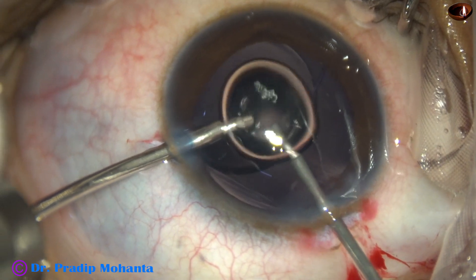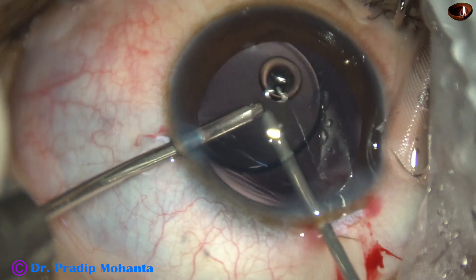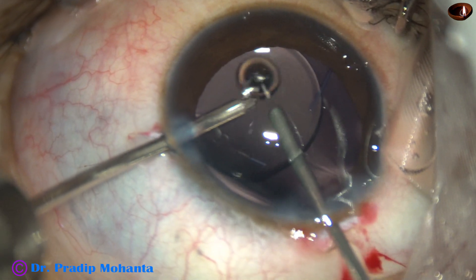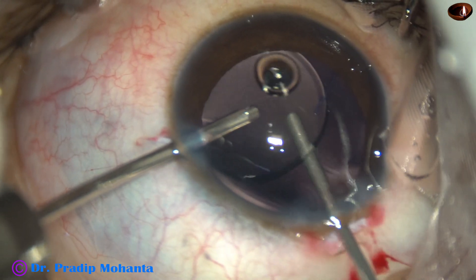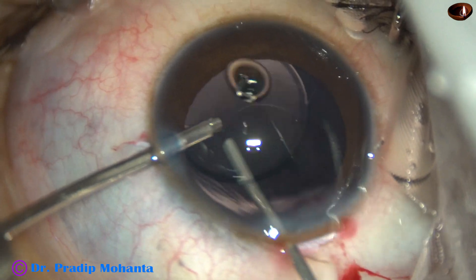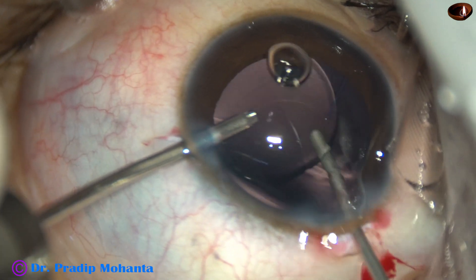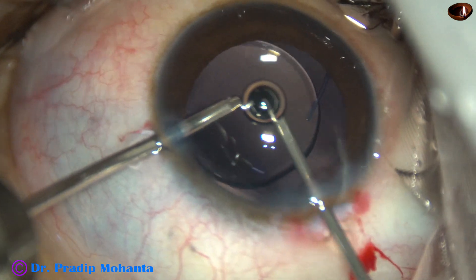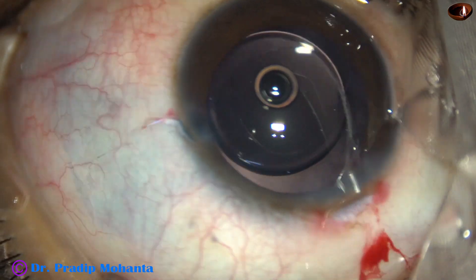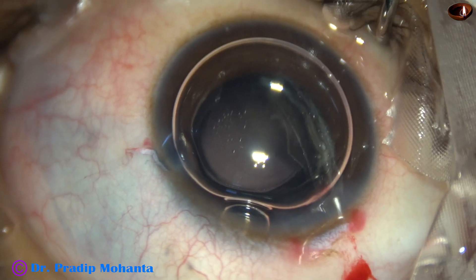Irrigation is over the intraocular lens, and we are cutting the vitreous as well as an adequate amount of posterior capsule behind the lens, so hydration of the vitreous is controlled. Hydration and prolapse of the vitreous into the anterior chamber usually doesn't occur with this technique. The term vitrectorexis is one I heard from Dr. Love, a renowned paediatric ophthalmologist in Kolkata.